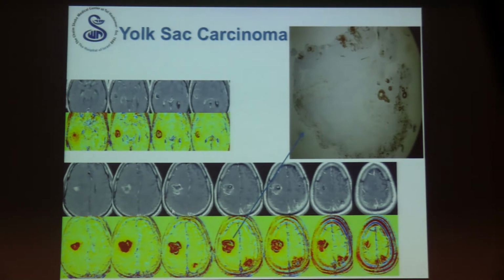So we scanned the patient, and you can see that all 3 lesions look mostly red. There's a thin blue rim, but it's like 90% at least red. Therefore, from our point of view, this is radiation necrosis.